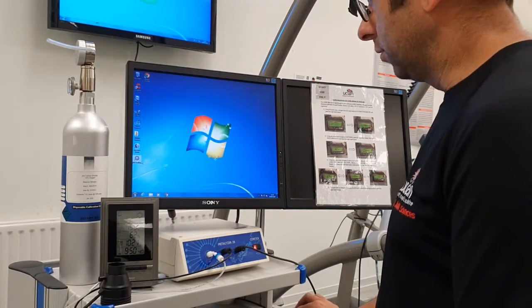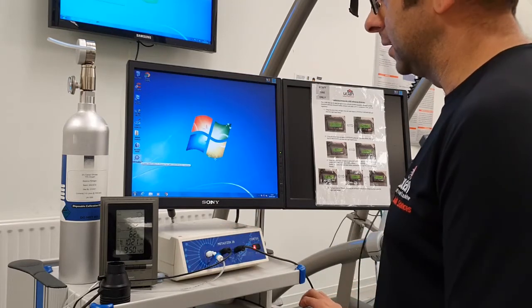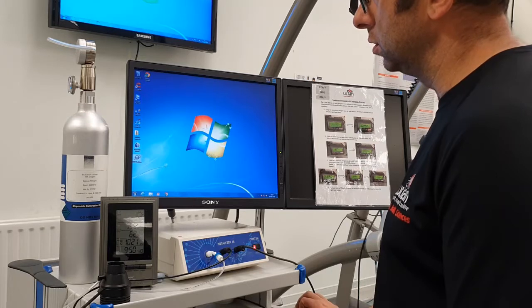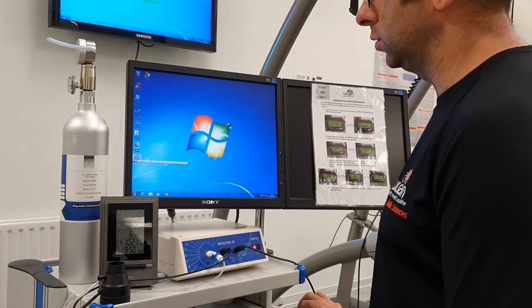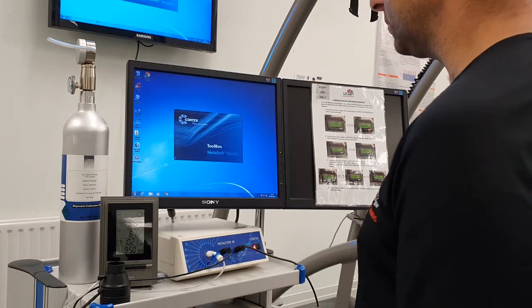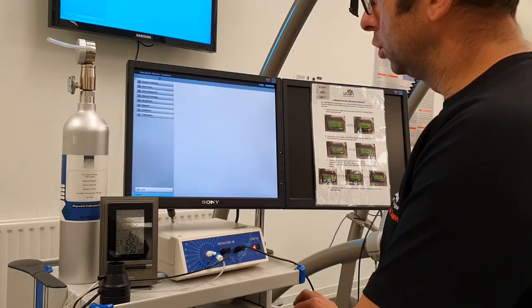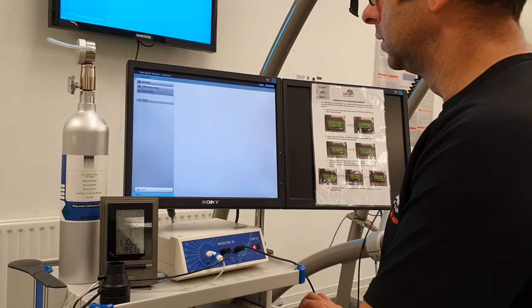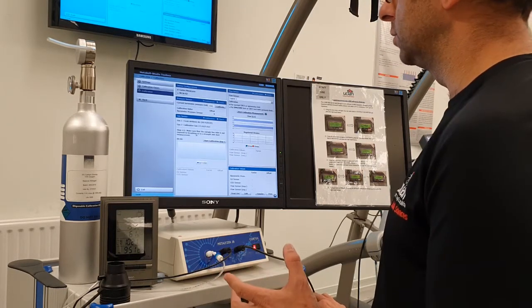In this video I'm going to go through how to calibrate the Cortex Metalyzer gas analyzer. First thing you need to do — you'll see two icons on the desktop — we want to go into MSS Toolbox first, so double click that. That will open up a number of different menus. The only one you need to look at is Calibration, so click on that. It's a three-part calibration process.